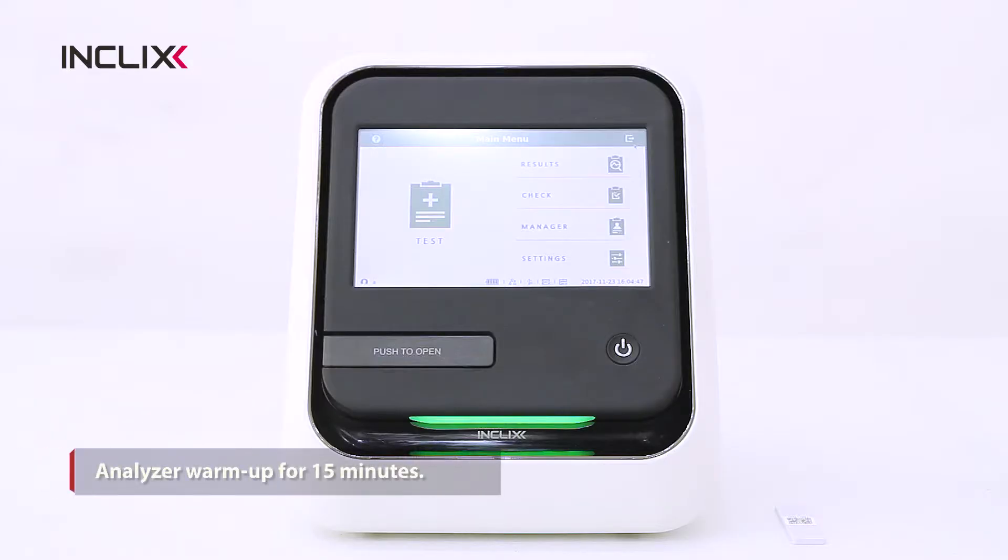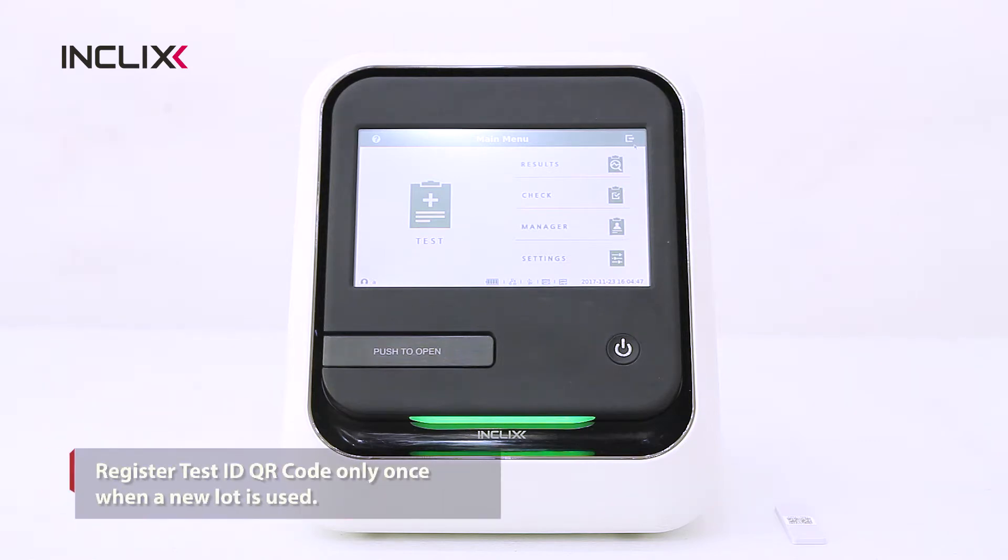When you turn on the analyzer, allow it to warm up for 15 minutes. Register the test ID QR code only once, when a new lot is used for the first time.